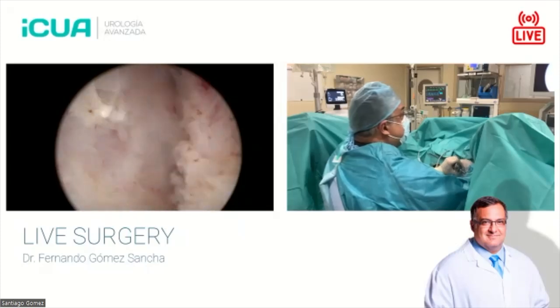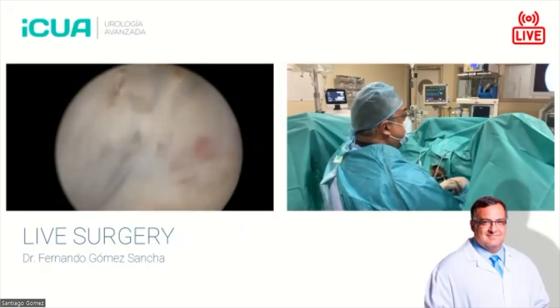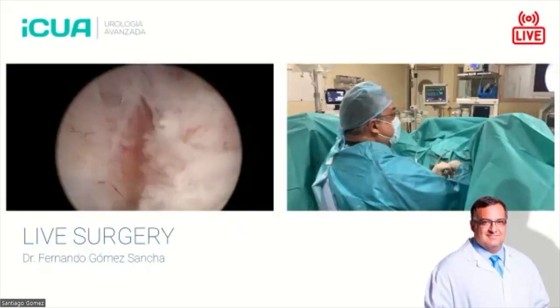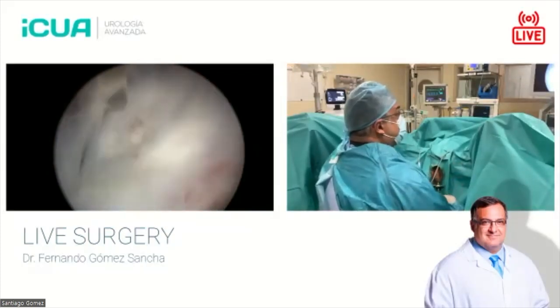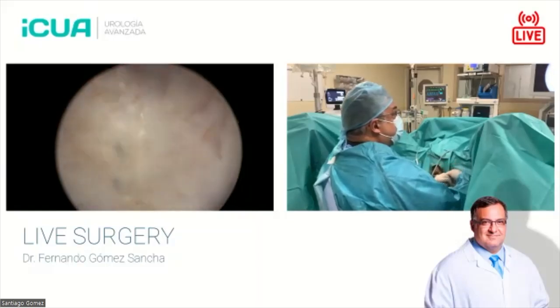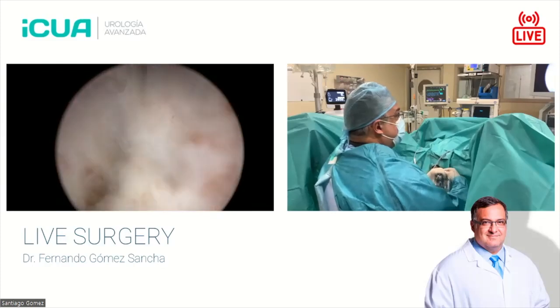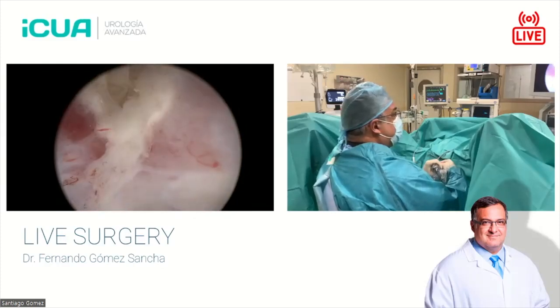And then of course, don't stay very close to the sphincter. Just go a little bit inside because you need some mobility. You need some mobilization of the apex to be able to reach the anterior part. And Fernando, some people say that on the anterior part of the prostate, there is no layer. Do you agree or not?